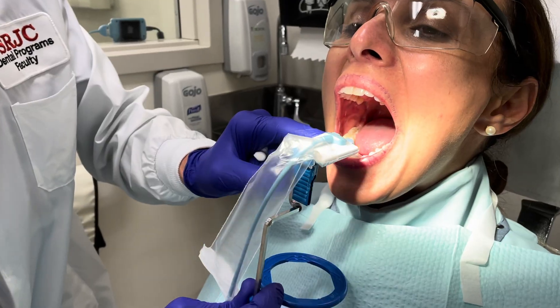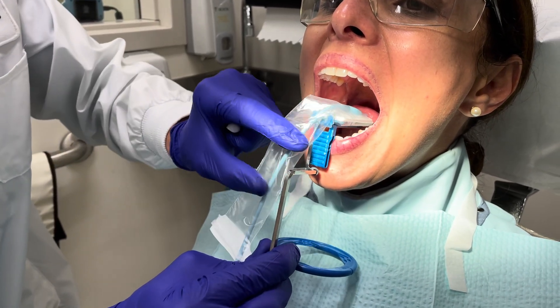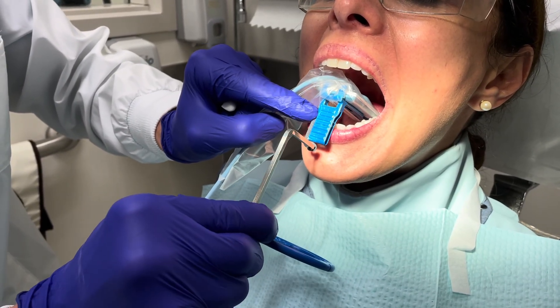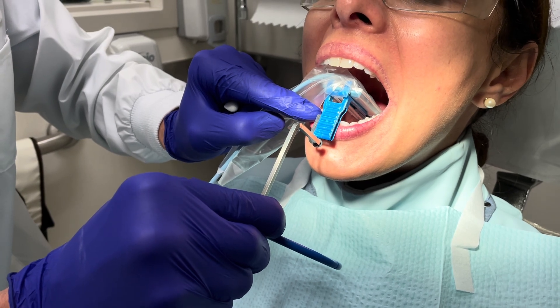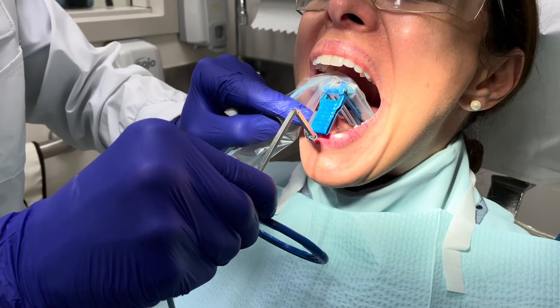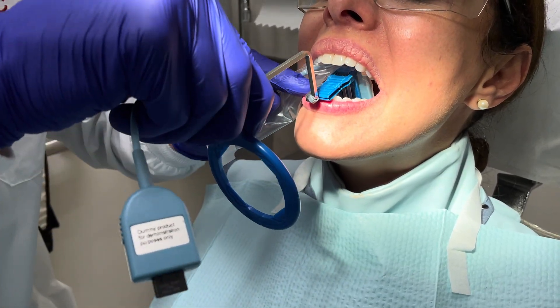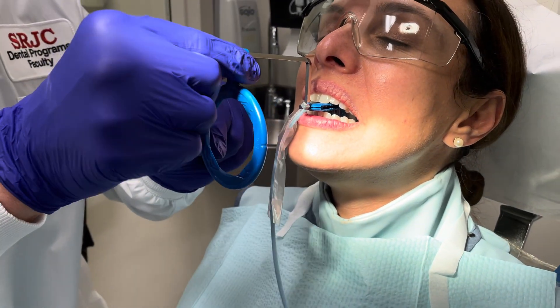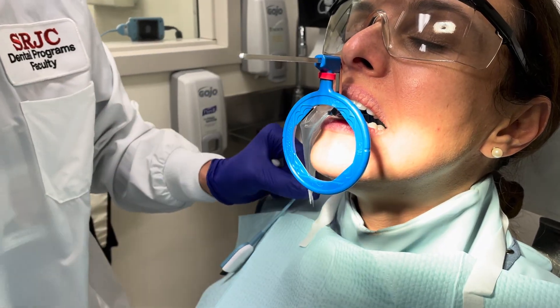So we're going to bring this in parallel to the occlusal plane, and it pushes back under the tongue, getting the bite block to touch the teeth right down there in the front. I can't push any harder, but as she slowly closes, I can start pushing in. Open slightly. Try again — close all the way. So you see how we're able to bring that slowly in her mouth as she was able to close.